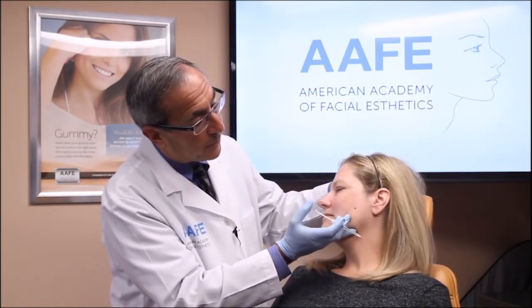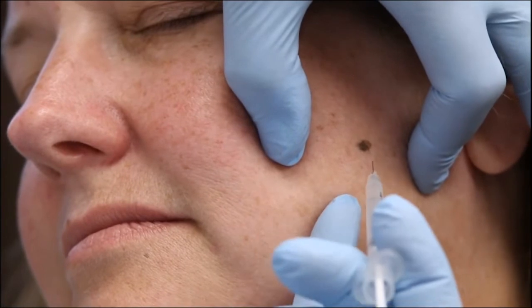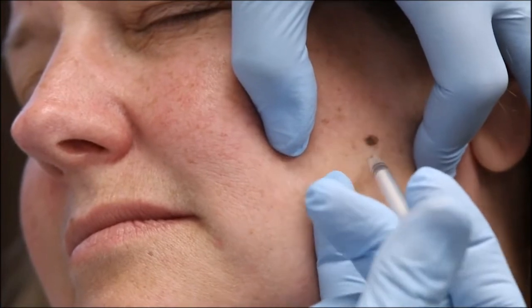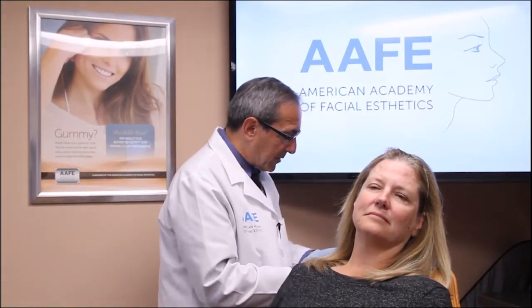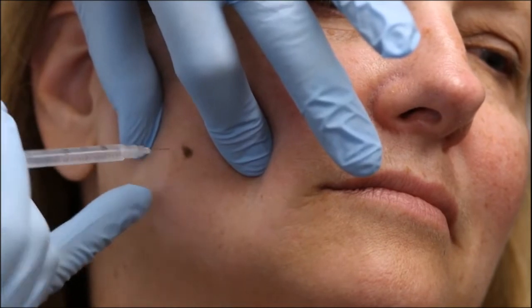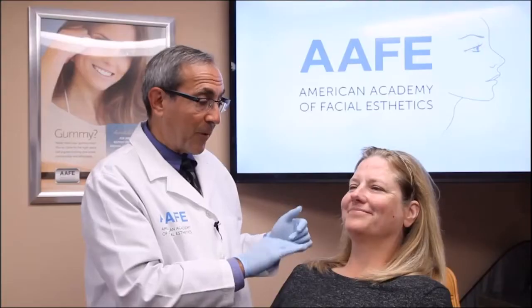Now for the masseter injections — these are real quick. Bite your teeth together so I know exactly where I'm at. With masseter injections, as fast as you can give it is still not fast enough, so just lay it in there. All my syringes are already pulled up — that's how it should be in every office. This side is the bigger side so it gets a little more. Bite your teeth together again — go right next to it, get it into that muscle. And you're pretty much done with the botulinum toxin injections!